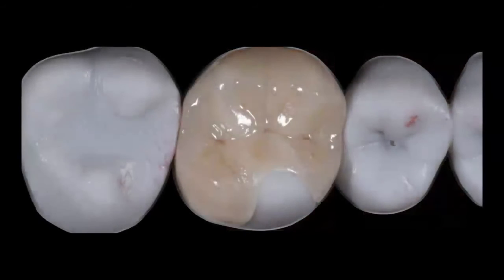So another option that you have is that many of you may get your restorations etched from the lab. So you receive your restoration, and the restoration has already been etched with hydrofluoric acid from the lab. If that is the case for you clinically, the question would be, what do I do? Do I need to re-etch the restoration after I try it in with hydrofluoric acid? And the answer to that question is no, you don't.